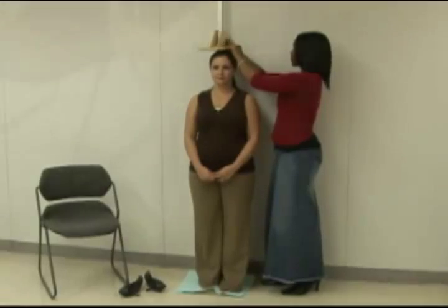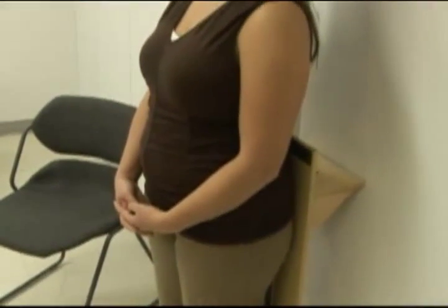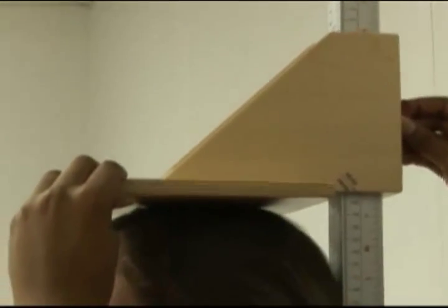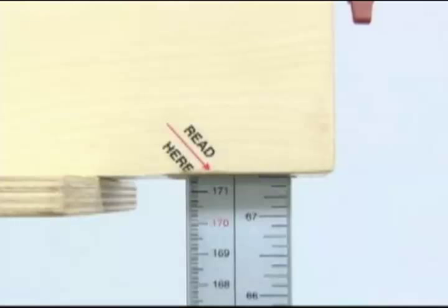Have the client stand under the headboard. Make sure the heels, buttock, shoulders, and head are all flat up against the vertical beam before lowering the headboard, because this will help ensure an accurate measurement. Then loosen the wing nut that holds the headboard in place and lower the headboard gently onto the client's head and re-tighten the nut. Read the measurement at the read-here arrow, or designated line, to the nearest one-eighth of an inch.